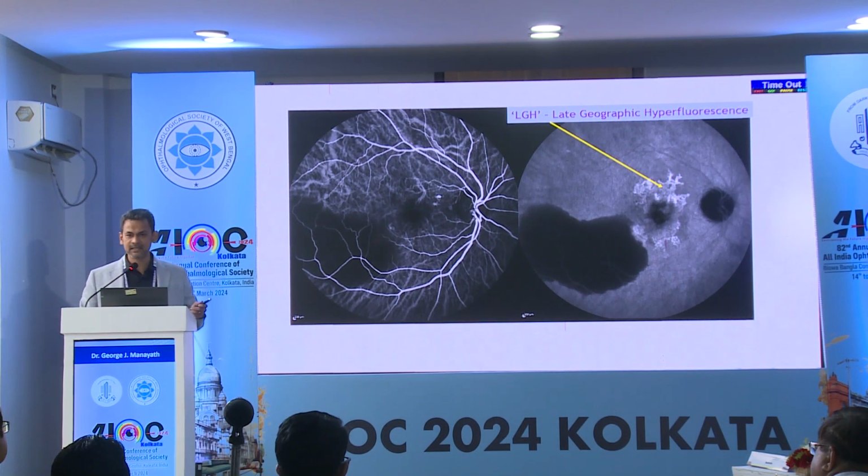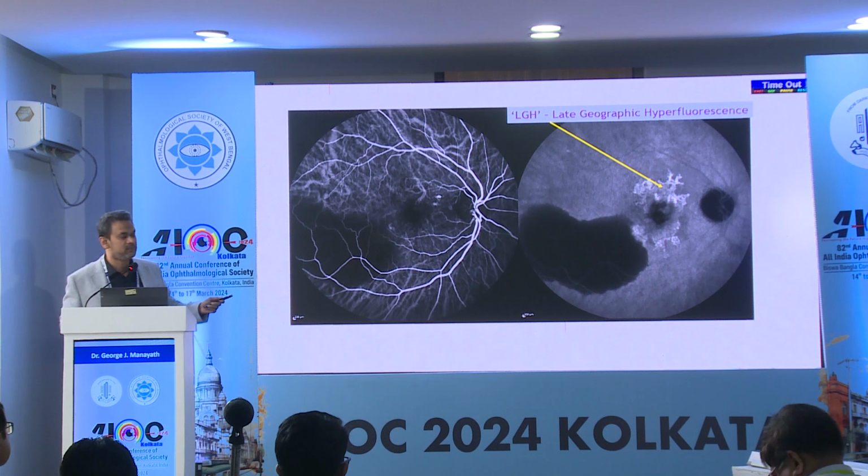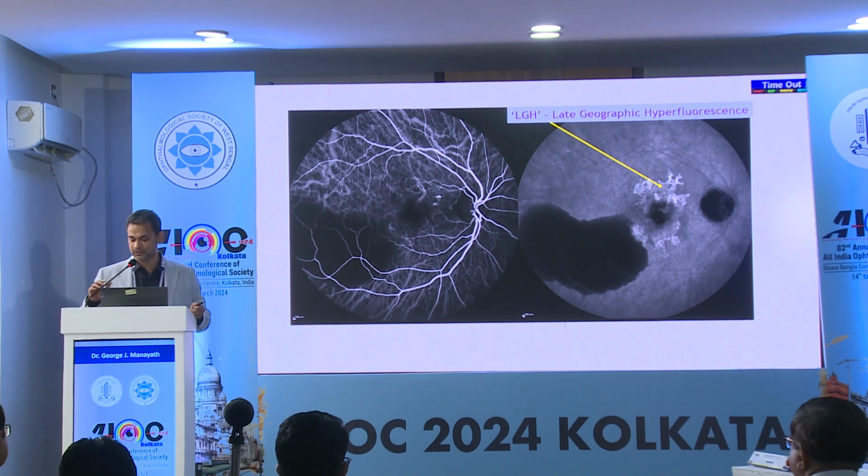And in the late phase ICG, look for this specific finding, that is the LGH or late geographic hyperfluorescence, which is highly specific in the diagnosis of PCV and not in other types of CNVMs.